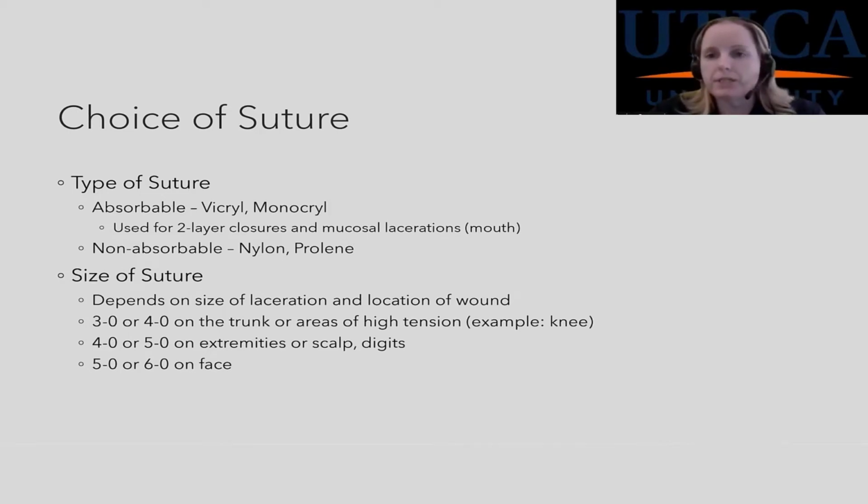Everybody has a different preference on what they like and what they don't like in regards to type of suture and size and brand and everything else. So everybody has a preference. I definitely have a preference, and you may develop that too. Because I like a specific one, I like the way it feels, I like the way it moves in my hand and all that stuff. And so you may develop that too.